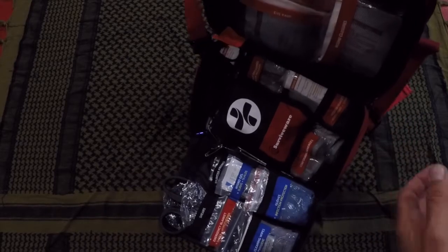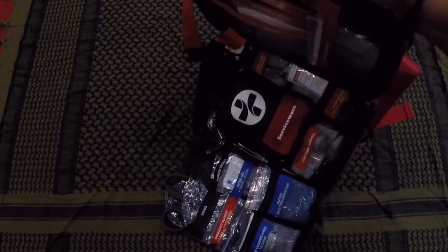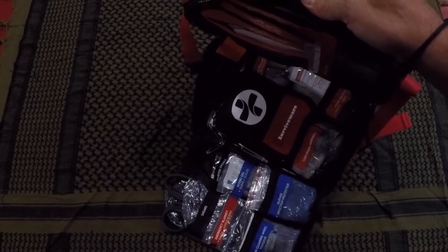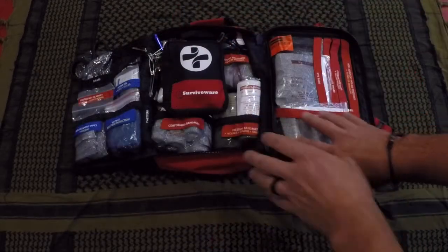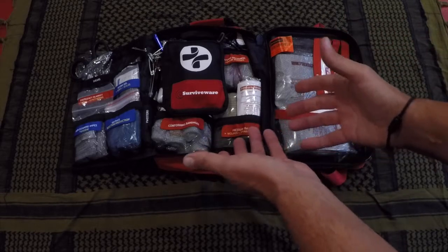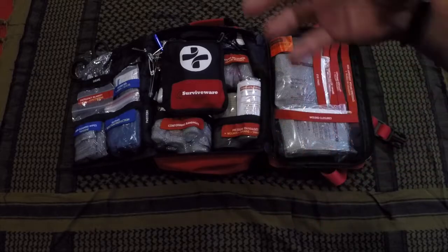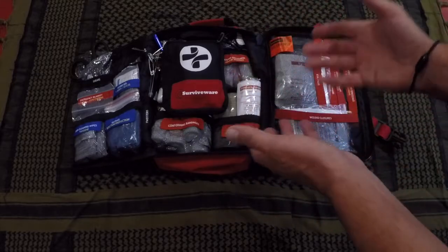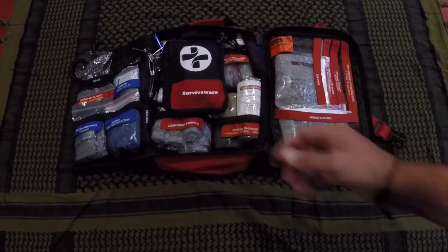Having that labeling gets treatment going that much quicker, and obviously the patient will fare that much better. What I also like about these components is that they are quality. A lot of kits out there — even more expensive ones — contain more items, but then you go to touch those items and they feel like they're going to fall apart or dissolve in your hands, let alone treat an open wound.